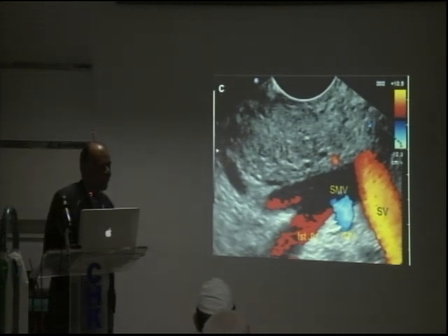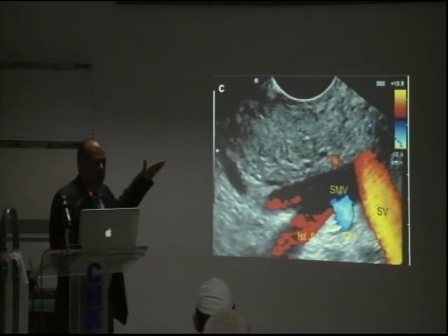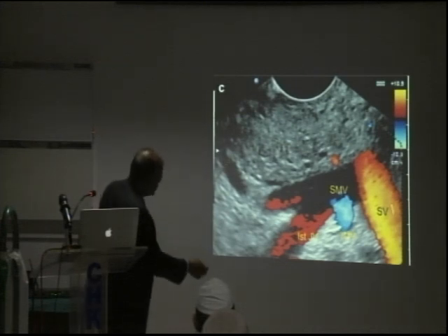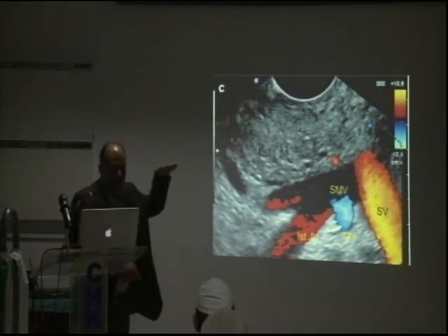Here's a hint. D2. Okay, so they remember what you tell them. Now it makes sense, isn't it? The splenic vein is coming from where it should be coming. The patient is lying like this. Spine is in the center. You're looking at it from like this. The pancreas is like this, right? So the splenic vein is supposed to come like this. The mesenteric vein is supposed to come like this. The jejunum should join like this, and the inferior mesenteric. Now it makes anatomical sense.